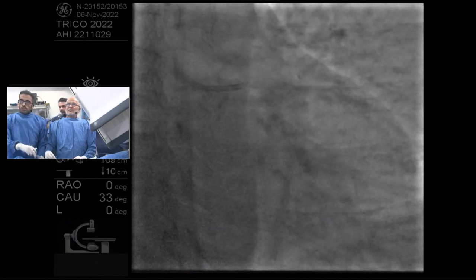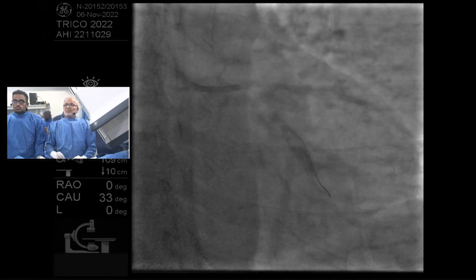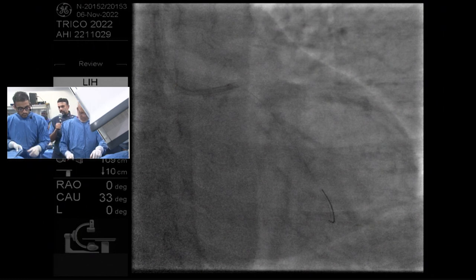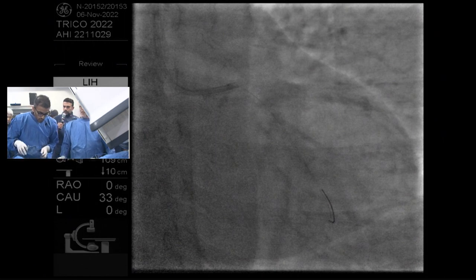The first steps in zero contrast PCI after periprocedural hydration is going to be to put a wire down the LAD or down the circumflex and IVUS the left main. Give me another wire. That was pretty straightforward. And the reason you put the wires down the major vessels is to create a wire skeleton so you have fluoroscopic landmarks through which we can do the case. Yeah. But give me another wire.